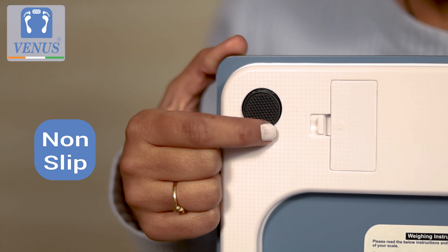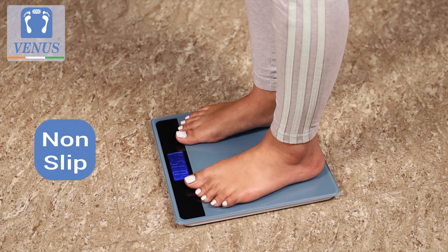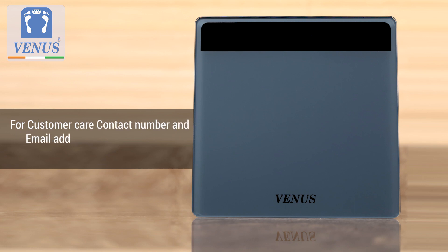The non-slip feet of the scale ensures safety on any flat hard surface. The full instructions to use are displayed on the label at the back of the scale with a customer care number and email ID to report any issues.